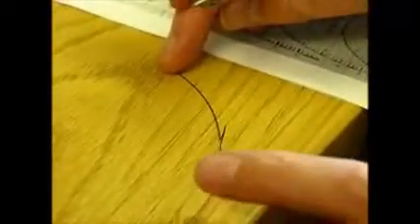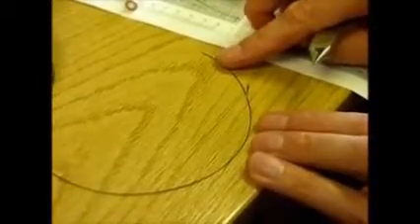Now that's not quite a right angle bend at that corner, so I'm just going to go back down a bit. But the thing is, it's knowing what to do when it's not quite right. That's the important bit. So it's really one of those things that you need to have a go at and see how you get on. Now I'd get that as near flat as possible at this stage. If they're not the same length, so let's make the next one.